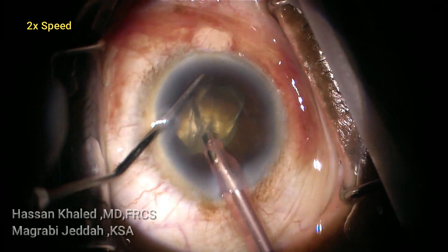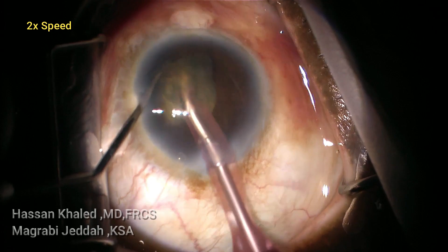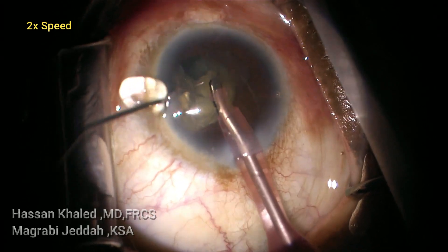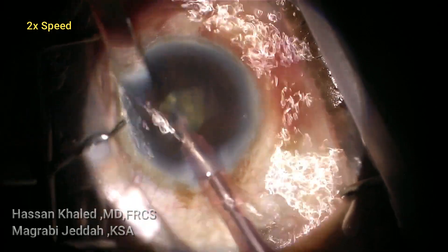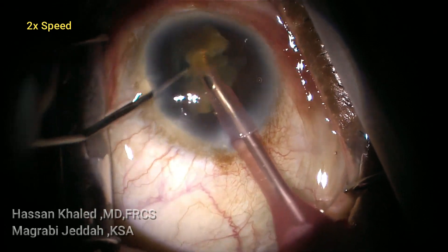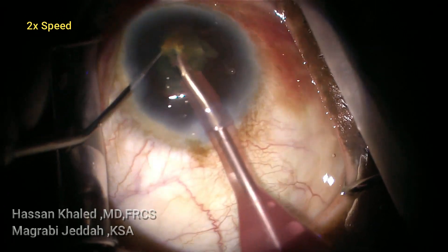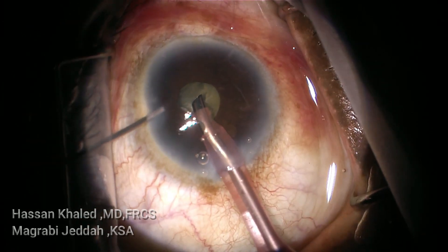You can see how the iris is floating in the anterior chamber — it's floppy iris. You can see how the pupil is constricting. Again injecting dispersive OVD to dilate the pupil and using the chopper to rotate and to push the iris away from the phaco tip while emulsifying this dense cataract. You can see the posterior plate is not chopped well during the vertical chop technique.